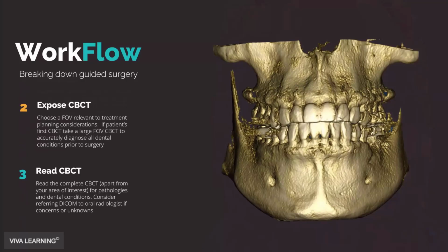Like I said, if it's my patient's first ever scan or they're a new patient, I am going to get a full field of view scan so that I'm not treating number 19 and missing an impending abscess on 14, for instance. Going to read the CT completely. We'll talk about how I read CTs in the second half of this webinar.